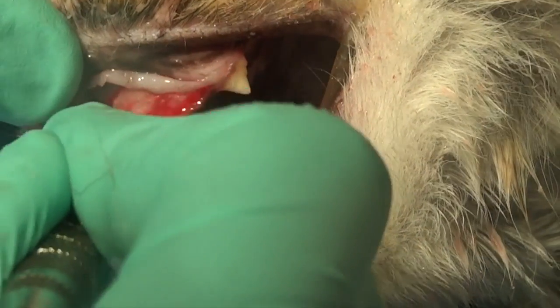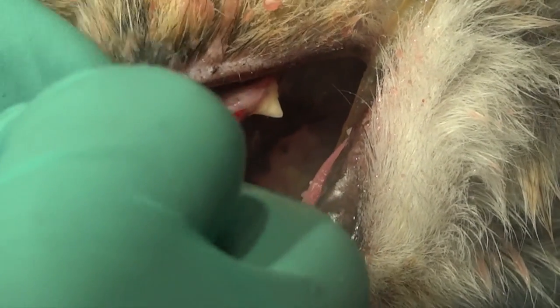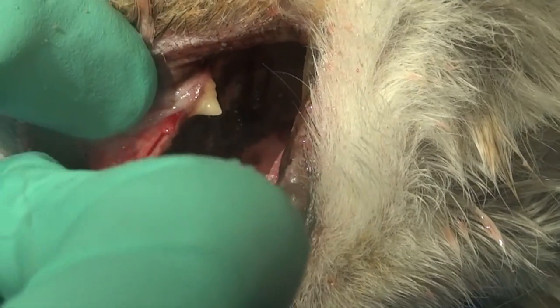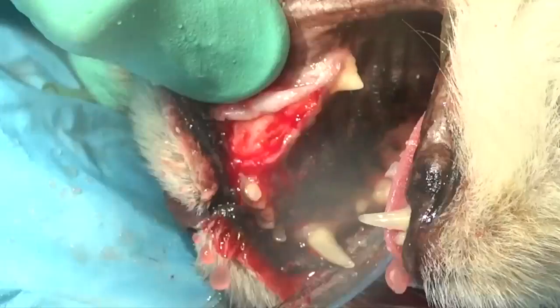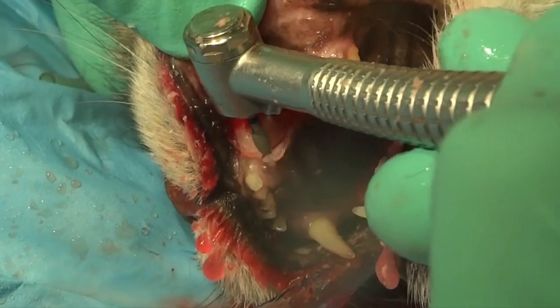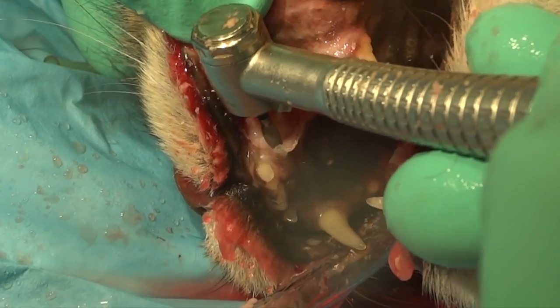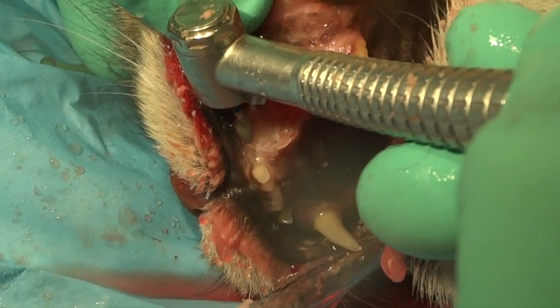Here we're going to elevate a little bit more on the rostral aspect of the attached gingiva. Then we're going to come down on the palatal aspect and overcome that little ridge that's almost vertical and allow room for our sutures to be placed. We're going to be using 5-0 monocryl, which in my practice is the suture of choice for cats, and we use a P3 needle generally. Here we're using the diamond football burr to take a little bit more of the bone away around that attached gingiva and smooth that out.